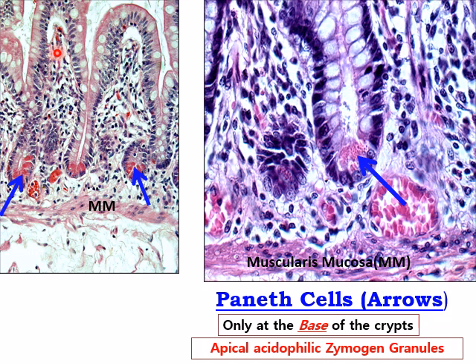This is the connective tissue corium, like a finger. Here is the crypt. From where, doctor, do we know that this is the crypt? I can see connective tissue in between the crypts, lined by simple columnar epithelium with goblet cells. In the crypt, I have a cell known as a Paneth cell, characterized by basal basophilia and apical acidophilia.